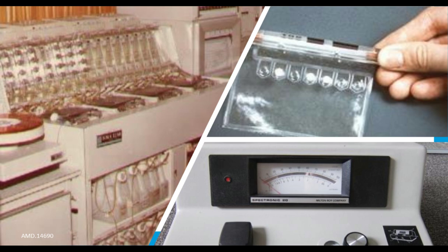It's a fairly recent event to have middleware in the traditional chemistry, immunochemistry, urinalysis, et cetera world. It's perhaps even more new to molecular. And I'm showing you in this picture what were three distinct yet isolated instrument tools used in the Clin labs in the 1970s. The SMAC, or the sequential multiple analyzer, that was used for high volume chemistries. The ACA, or the pouch chemistry from DuPont, that was used for discrete chemistries. And then a general use spectrophotometer from Milton Roy.